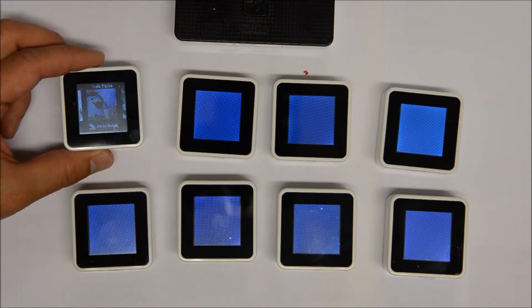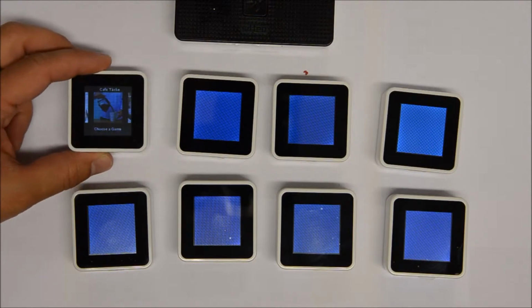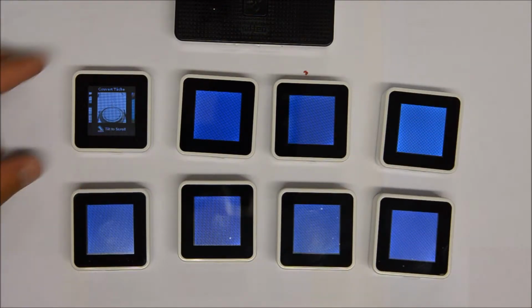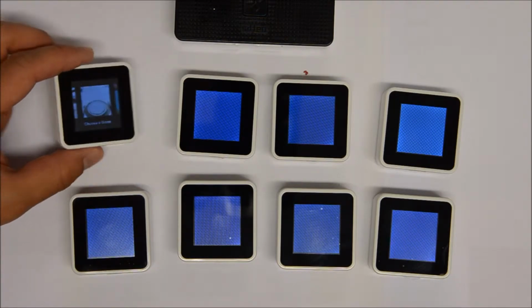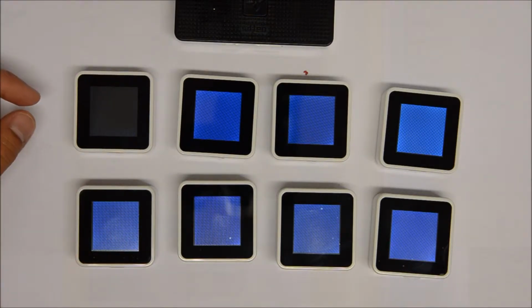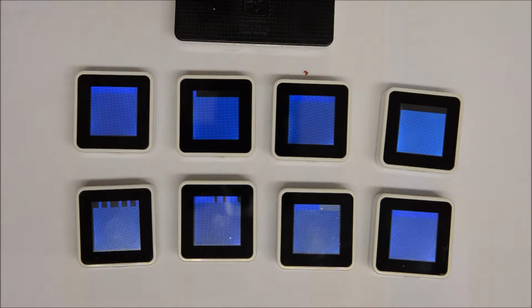For the range of kitchen tasks we have for Alzheimer patients, we have a different range of tasks that you can select in here by tilting the cubes that are in the menu. The cube order is randomized for study purposes. It displays a small line saying the task name and then an icon. So we click on the coffee task. We have a loading system here, a progress bar. Each of the cubes will have a different number of images to load. That's why they load at a different rate.